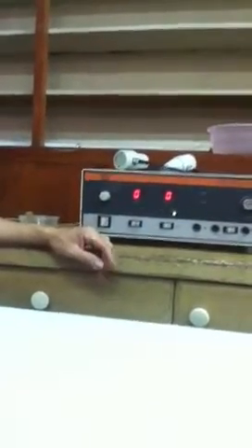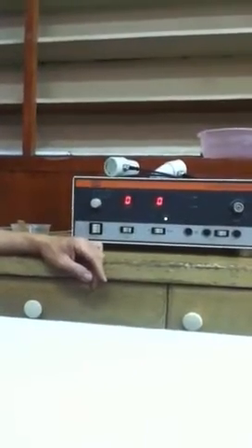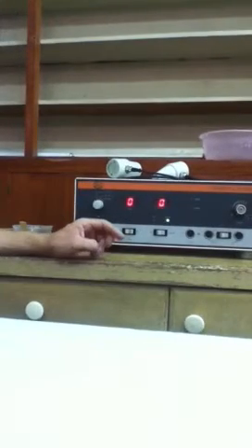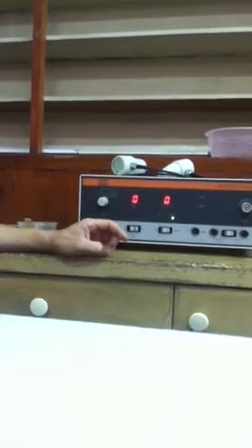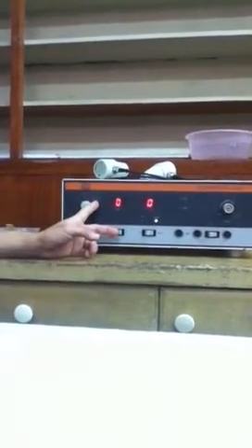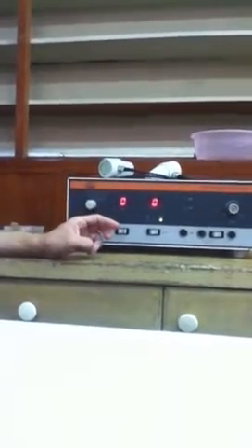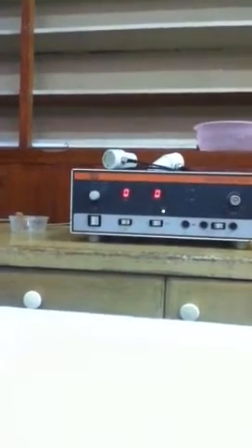If we compare all these 3 pulse ultrasounds, you would expect that the ratio of 0.5 is to 9.5 is the type of pulse ultrasound that gives the least thermal effect, or we can even say no thermal effect, because it delivers energy for only a very short time.